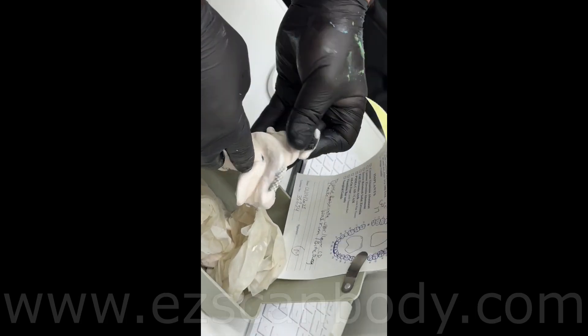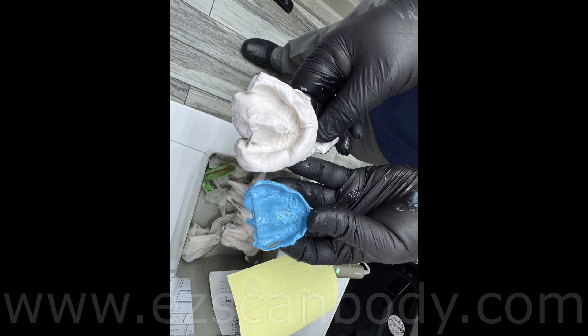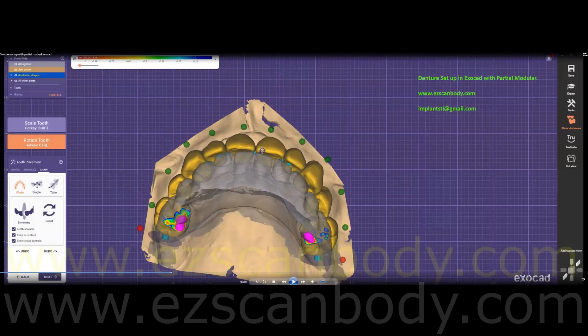Look how easy and comfortable scanning is compared to taking impressions. If you have any problems with scans, you can fix it in seconds, but with impressions it takes more time and wastes materials.